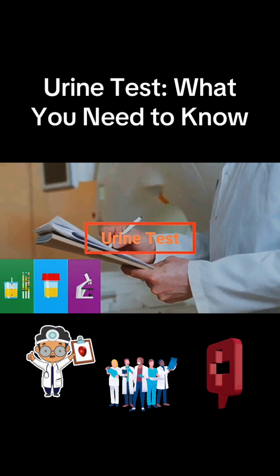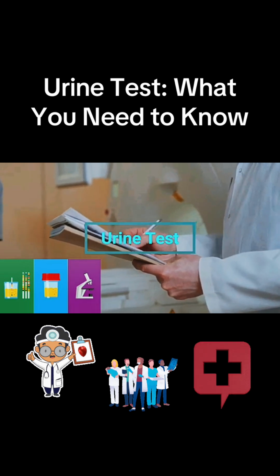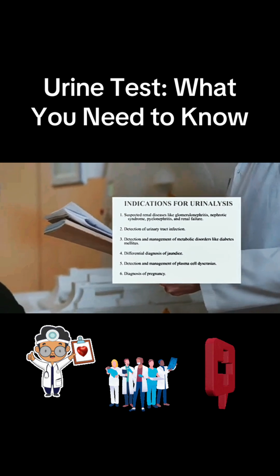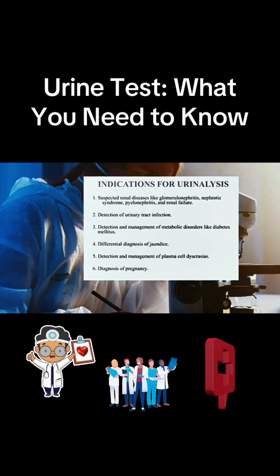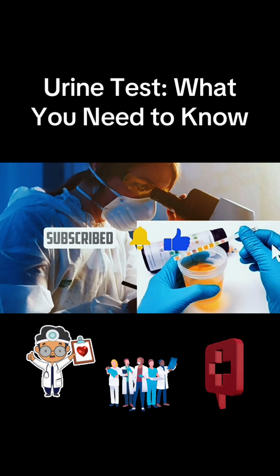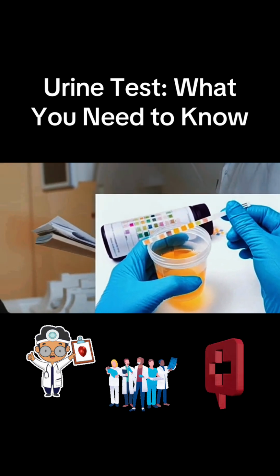A urinalysis, also known as a urine test, is a test that examines the visual, chemical, and microscopic aspects of your urine, pee. It can include a variety of tests that detect and measure various compounds that pass through your urine using a single sample of urine. Healthcare providers often use urinalysis to screen for or monitor certain common health conditions, such as liver disease, kidney disease, and diabetes, and to diagnose urinary tract infections, UTIs.